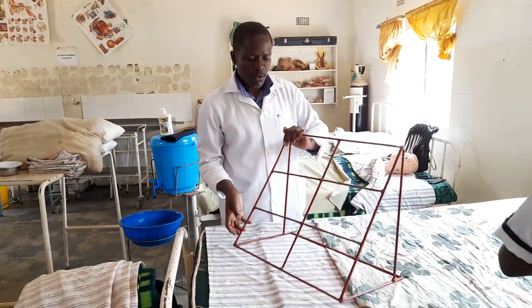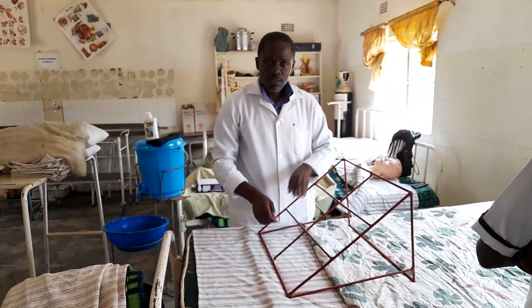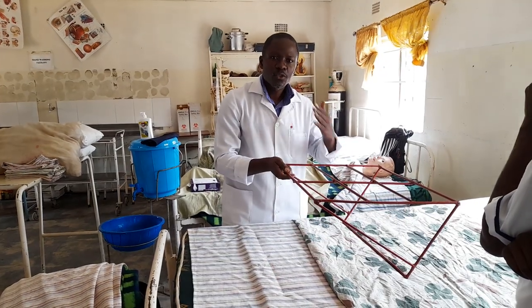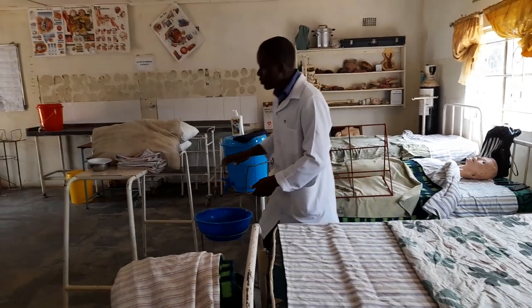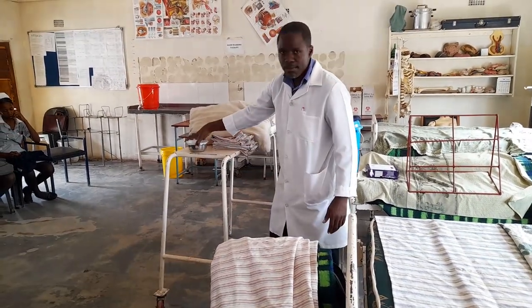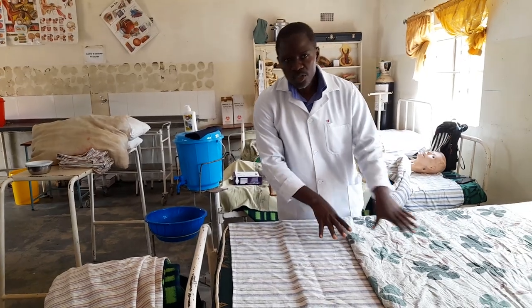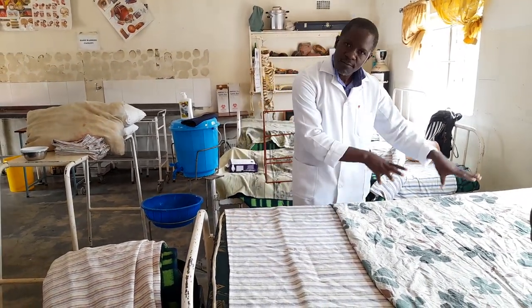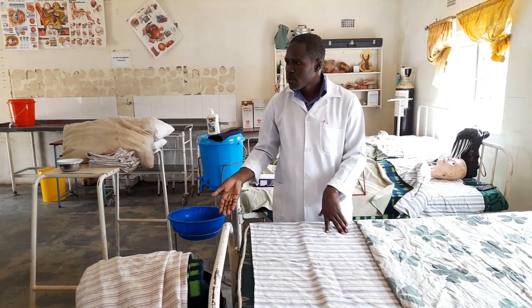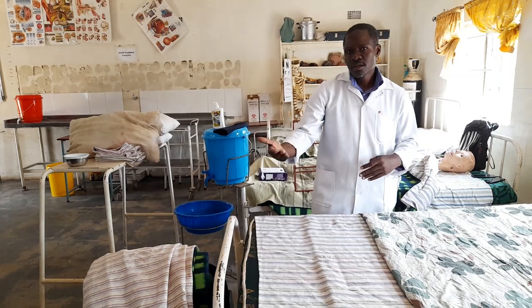Backrests come in different forms — there are those which are adjustable and those which are fixed. Even if it's fixed, you can try to improvise and see which position suits the patient. Some are made of plastic, some are metallic, so you go with what you have — at least the patient should be comfortable. The next accessory is the cardiac table, on which the patient can lean or where you place the sputum mug. The foundation is always the same; we just add accessories that make the difference.